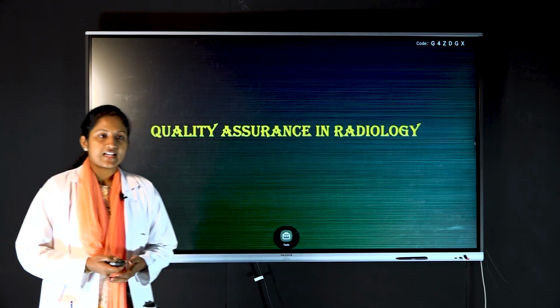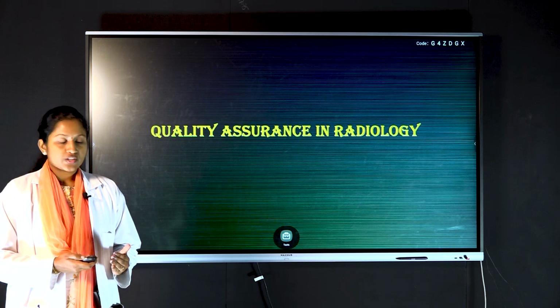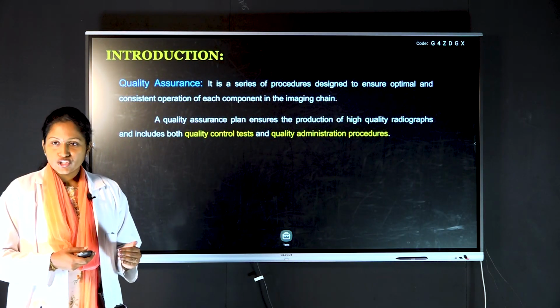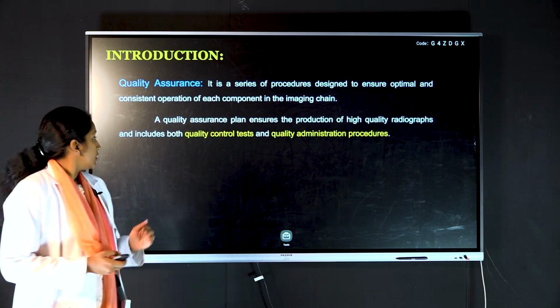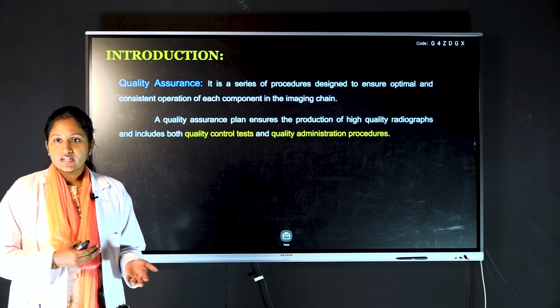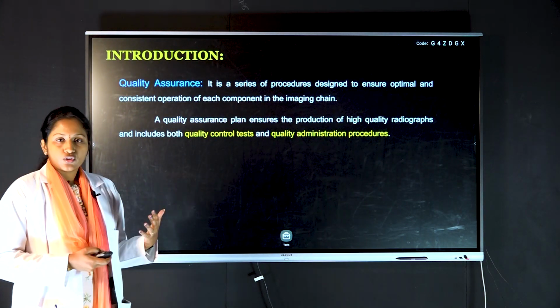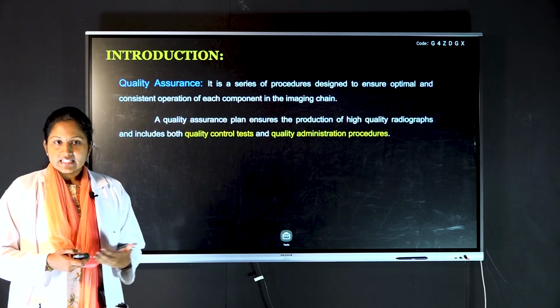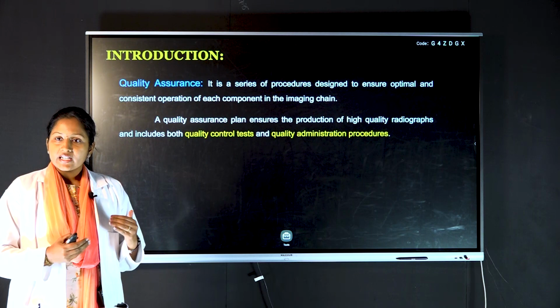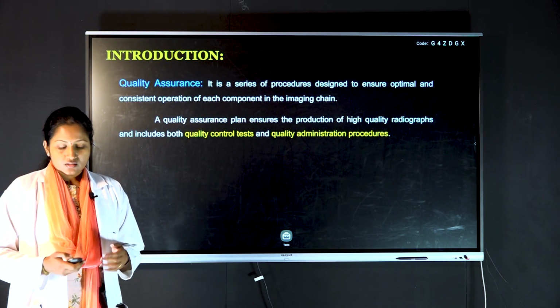Good morning. The class is about quality assurance in radiology. Quality assurance is nothing but a series of procedures that are done in order to ensure the optimal and consistent operation of the equipment that is used in radiology, so that the produced radiographs are of high quality. There is a protocol given for these procedures, and those include both the quality control tests as well as quality administration procedures.